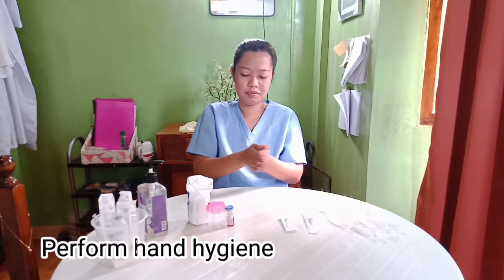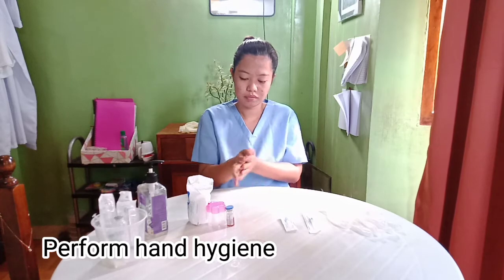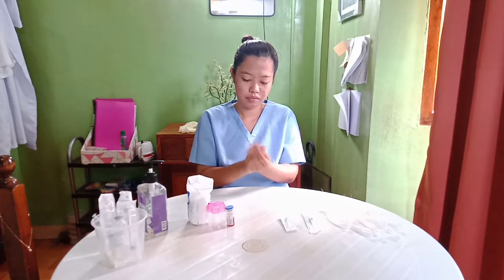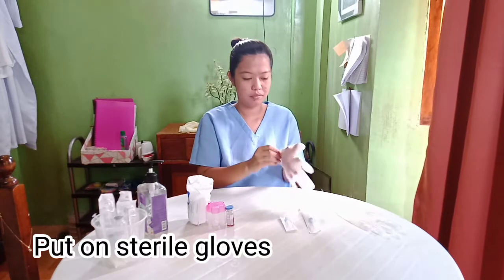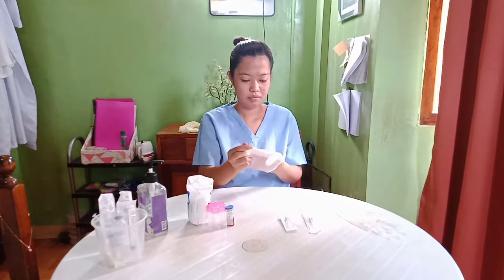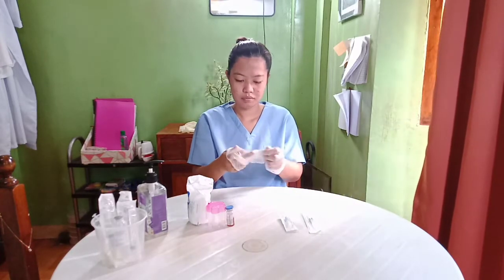Perform hand hygiene. Put on sterile gloves. Sterile gloves are worn for a reduction in the transmission of microorganisms between healthcare workers and patients, and vice versa.